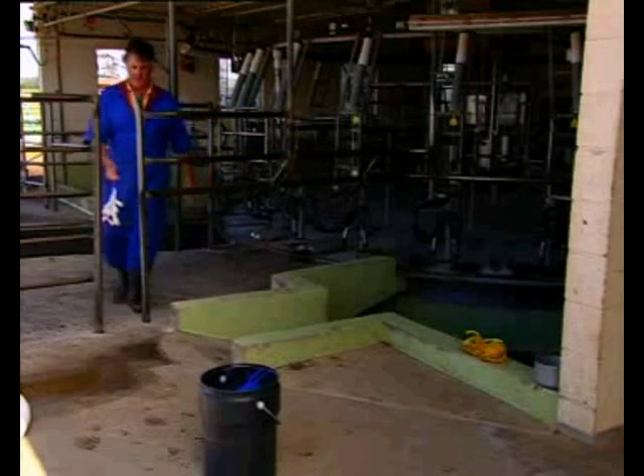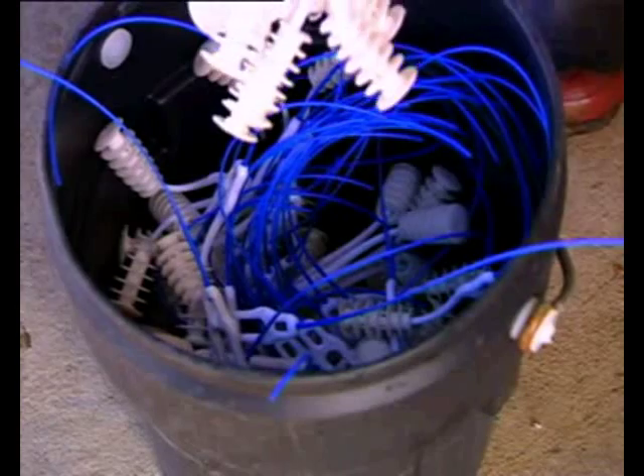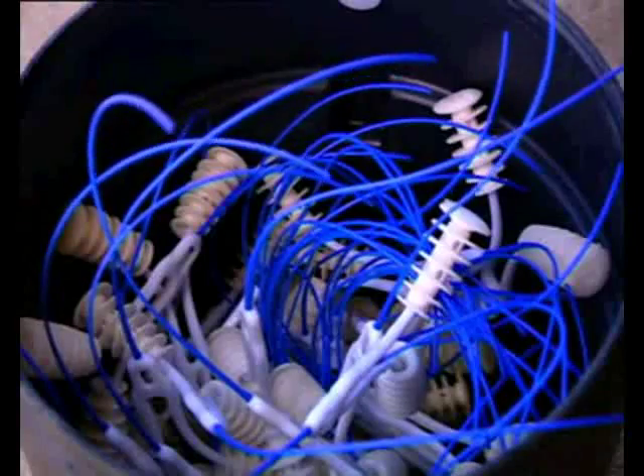It is normal for Q-mate pods to be coated in mucus. Mucus is essential for dissolving progesterone from the Q-mate pods. It is normal for some mucus to appear cloudy. Animals have been examined after treatment and this cloudiness disappears within 48 hours after device removal.